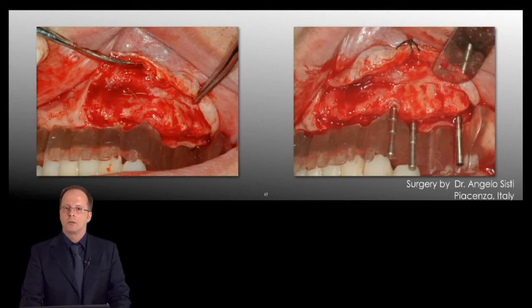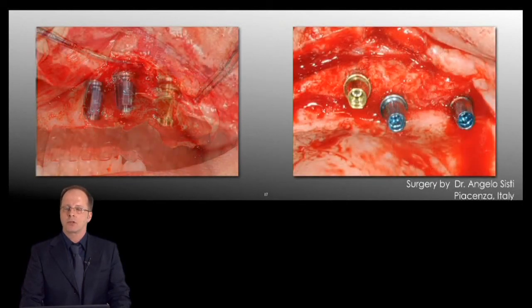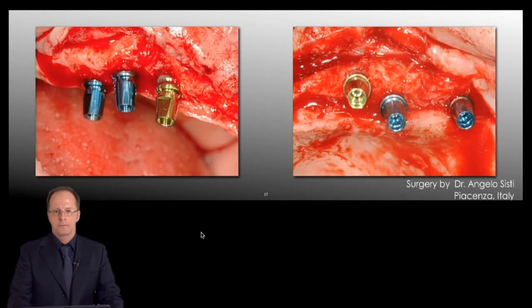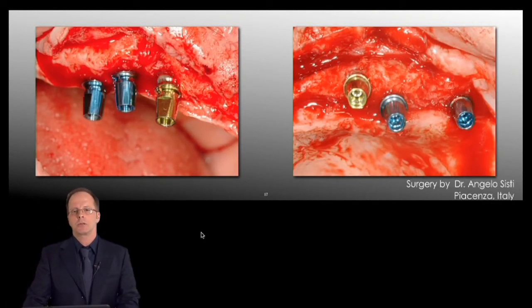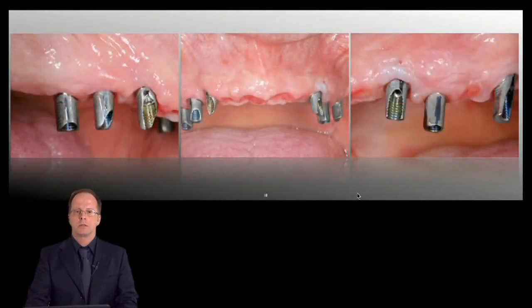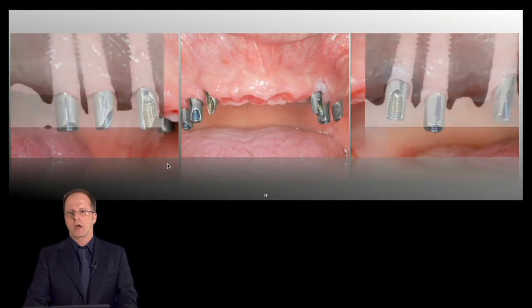We place the implants with a surgical guide in the right mesiodistal position. We've been using GIDE dense implants, 3.8 and 4.5 millimeters diameter, and with an immediate load procedure. And as you can see, the shape, the concavity in the frontal area after the immediate load with the provisional is quite nice. We get to the final prosthesis utilizing titanium abutments. As you can see, the fit of the framework is quite precise.